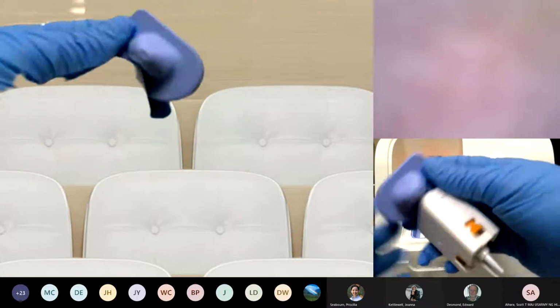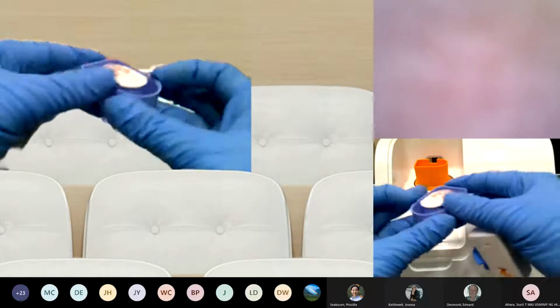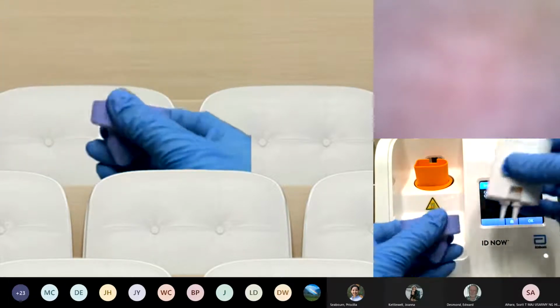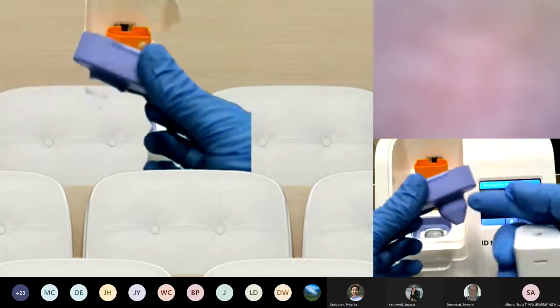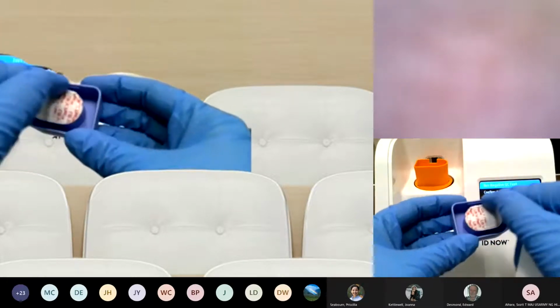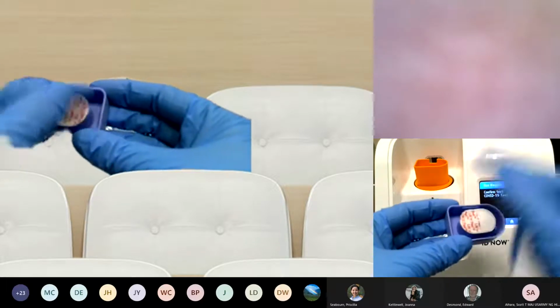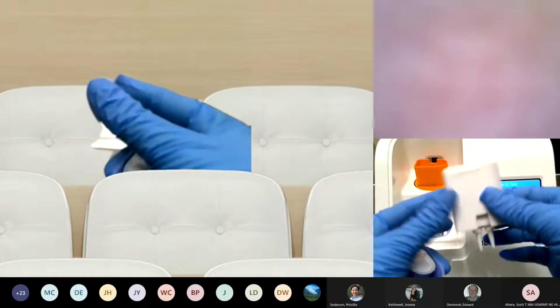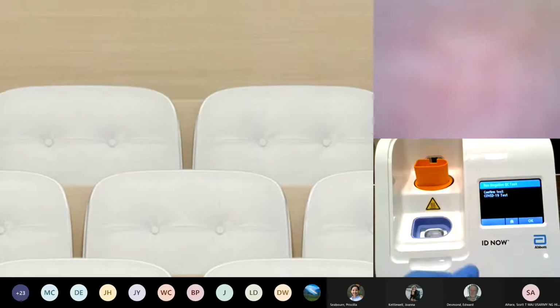And so you'll see that there are those two pieces, the sample receiver, as you can see here, and the liquid is down below in this region, and you'll see a seal. You're going to leave that little ketchup bottle seal there until the instrument tells you to remove it. The third piece is, of course, our white transfer cartridge.